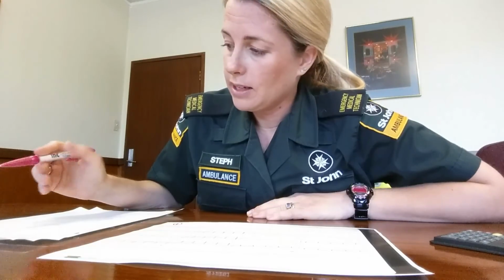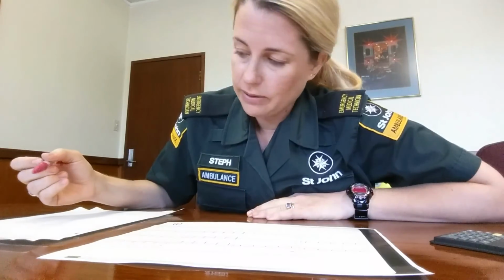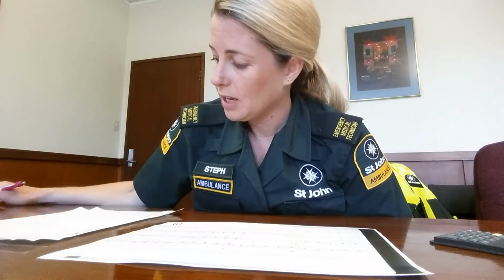Okay. Well, and he's a 56-year-old male, so you need more in the, well, V2 and V3, you'd need more than 2 millimeters of elevation, which you've got. So, yeah, inferior posterior STEMI. Right, that's your interpretation. Yes.